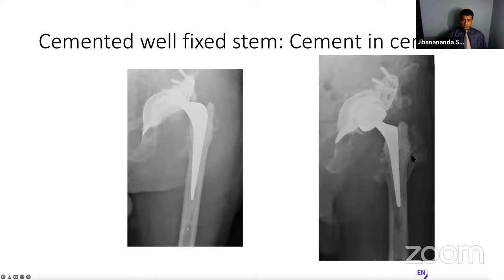And this is another technique you can use if you want to avoid ETO, particularly for a cemented stem that has a good mantle of cement and is not infected, obviously.